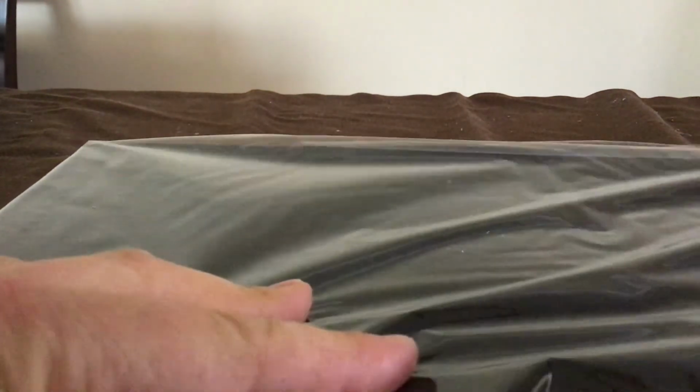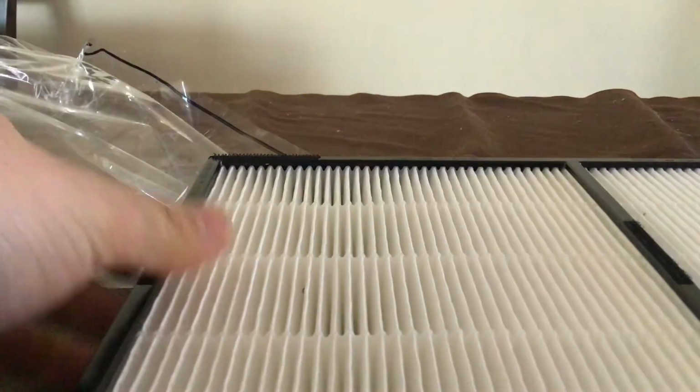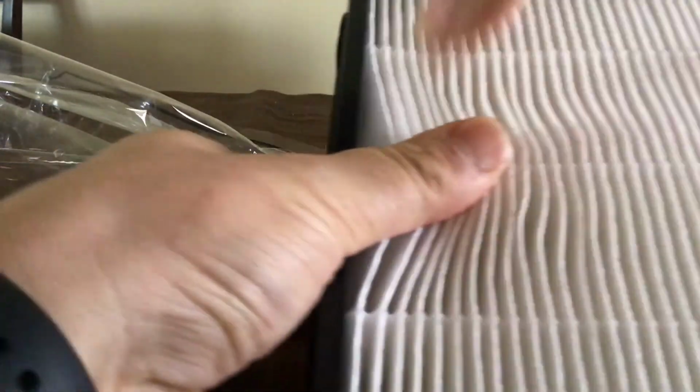This is a size A2 Filtrete HEPA filter, and we're going to take it out of its frame after we take it out of its bag. First we can remove the carbon layer because we're not going to be using that. And that just velcros onto the back. Then within the frame itself, you have the filter itself, and we're just going to slowly pull that away from the edges.